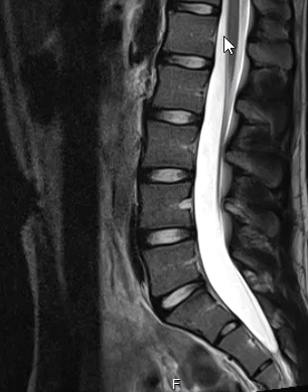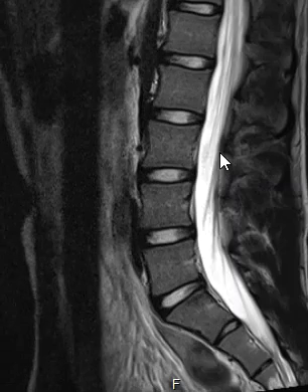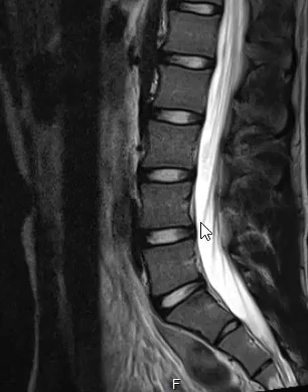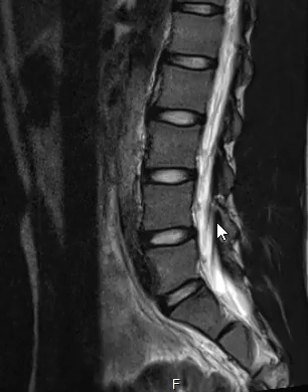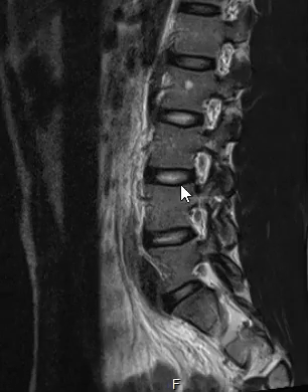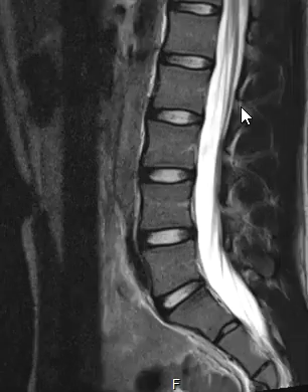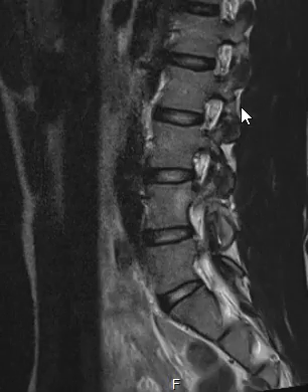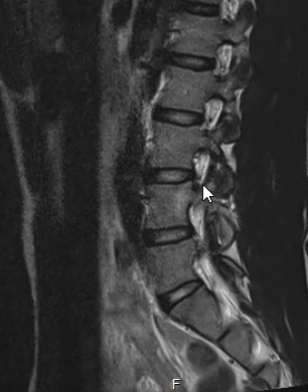The spinal canal is back here, filled with fluid which is really white. You can see each one of these nerves coming down like spaghetti through the spinal canal and exiting at each level.